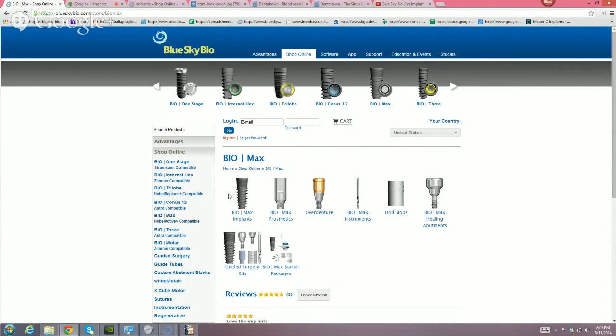Many of the implant companies are switching over to our thought of having a deeper thread pattern to transfer load, so that shorter implants work out better. And of course, better engineering means that some of the skinnier implants work. But it's a limit, and currently, I know maybe things are going to change in 4 or 5 or 6 years, but the absolute limit for a first premolar or a premolar would probably be 3.5, 3.7, a molar about 4, 4.3, 4.5, in that range.